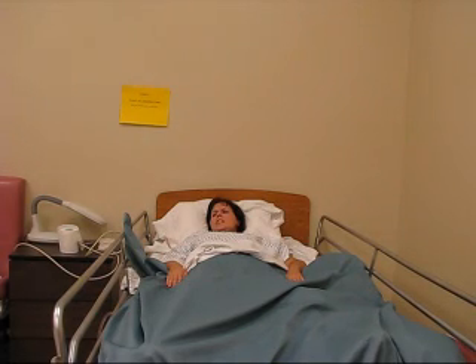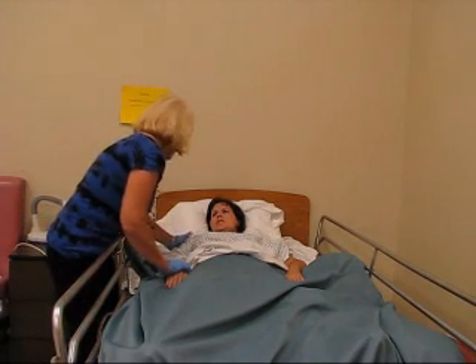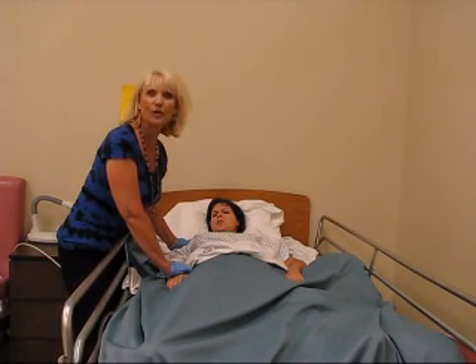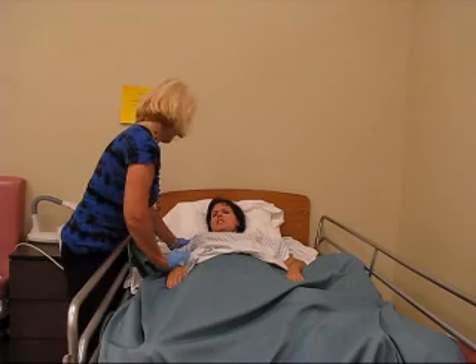Nurse! Nurse! Nurse! I need to poo. Hi, Mrs. Lindsay. I'm here to help. I'm going to help Mrs. Lindsay use the regular bedpan. She needs to have a bowel movement. I need to poo.